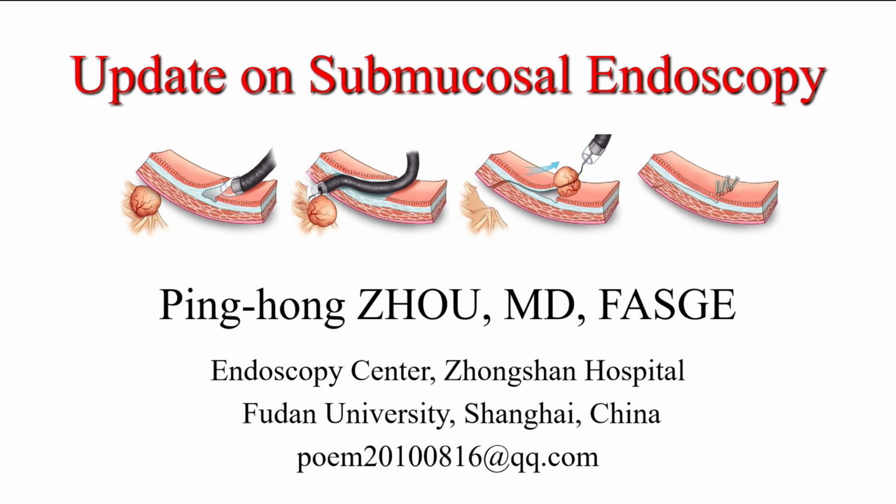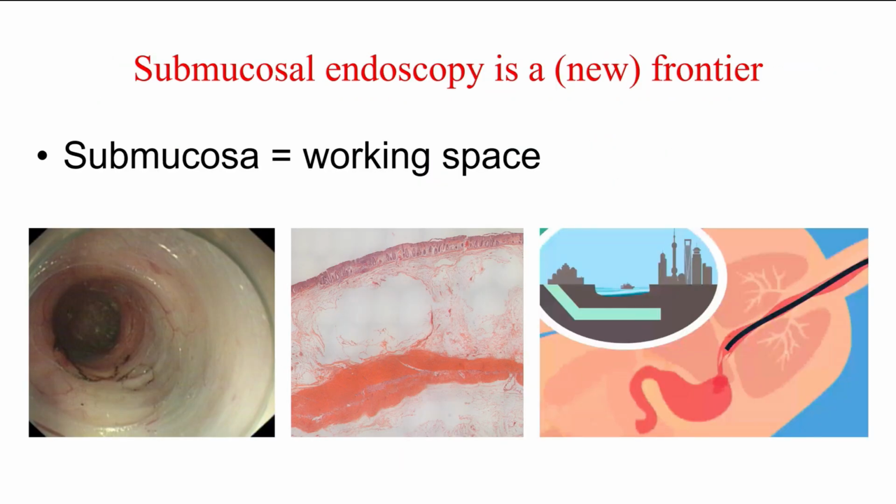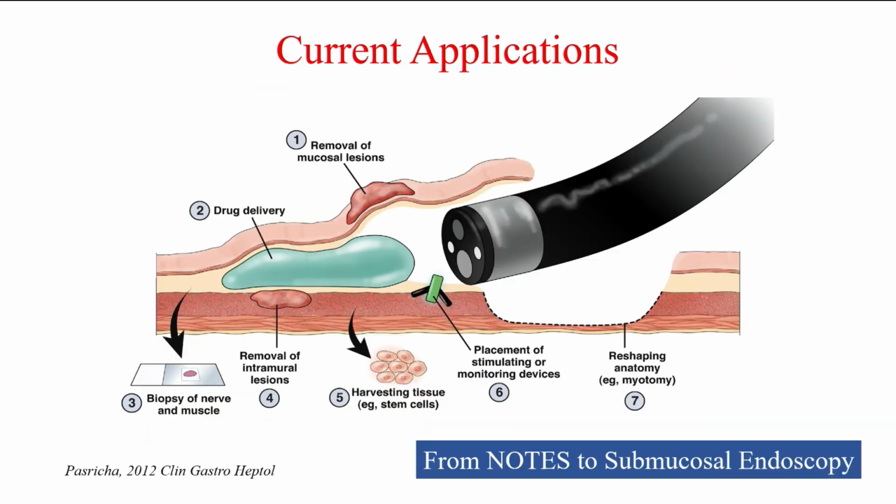In this section, I would like to talk about new advances in submucosal endoscopy. As we know, the submucosal space is a wide, loose space. It can act as a working space. So submucosal endoscopy is a new frontier.